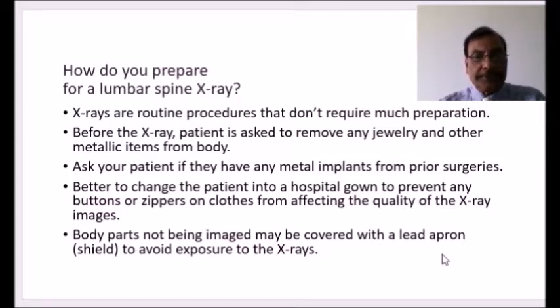Ask the patient to remove the dress and put on a gown, because the buttons or zippers on the clothes may affect the quality of the X-ray images. And body parts which are not being X-rayed should be covered by a lead apron to avoid unnecessary exposure to those parts.